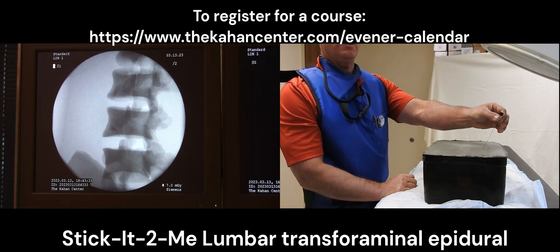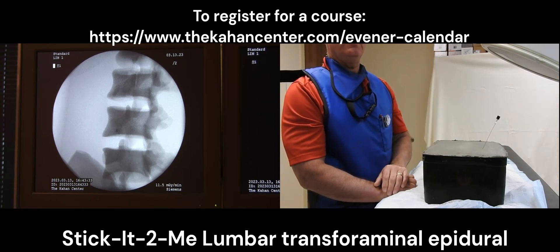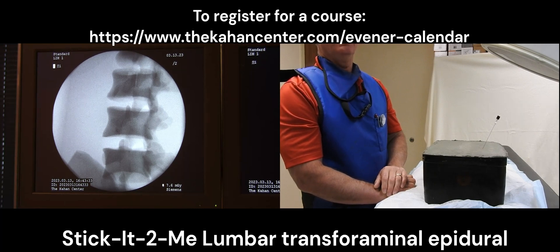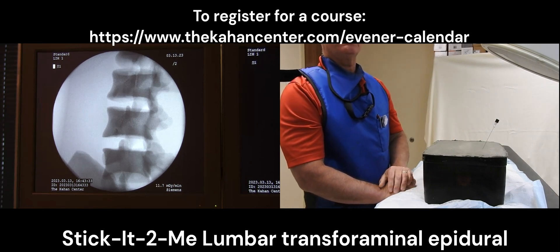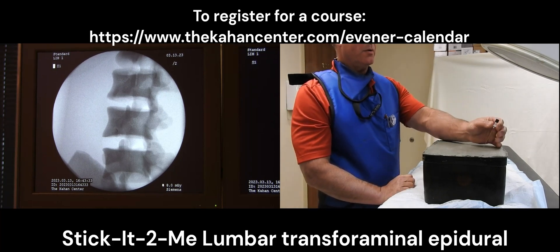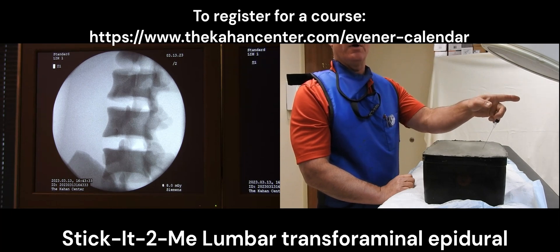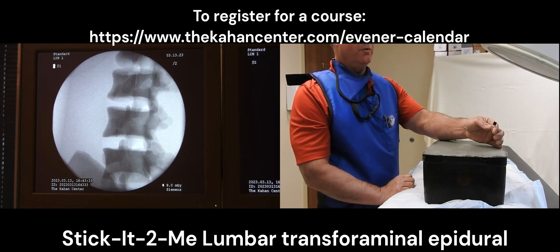We're now going to rotate it 180 degrees and steer it upwards into the neuroforamen as I advance it. Now the needle hub and needle tip are in direct alignment. At this point I can spin my needle as I advance it and it will gradually go straight down into the transforaminal space, just as when we're working with our patients. I then rotate it — the notch is pointing towards me so the needle curve is going away from me. I'm going to rotate it 180 degrees so that the notch is away from me and my needle tip will move towards me.